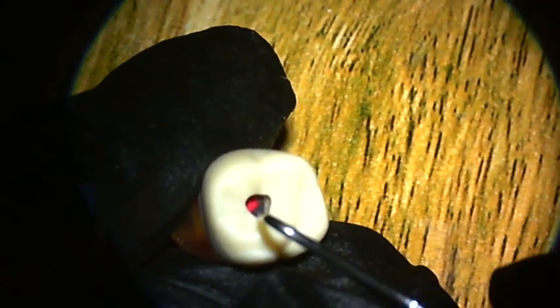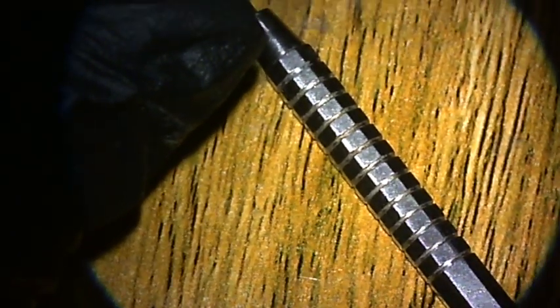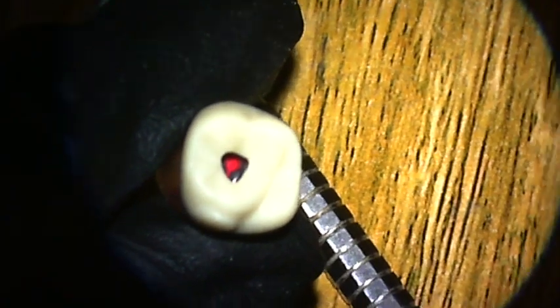Removal of internal tooth structure, which means the injury to the internal walls. Those parts should not be damaged or gouged. No gouges are allowed here. However, minor removal is okay, but if you cause gross gouges, it's not forgiven. A minor, small one is not going to affect your mark.